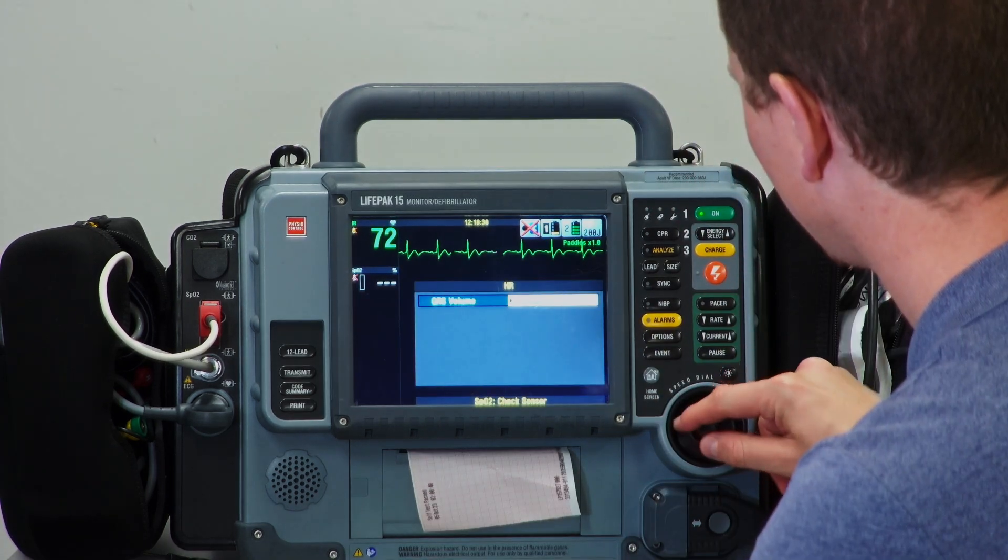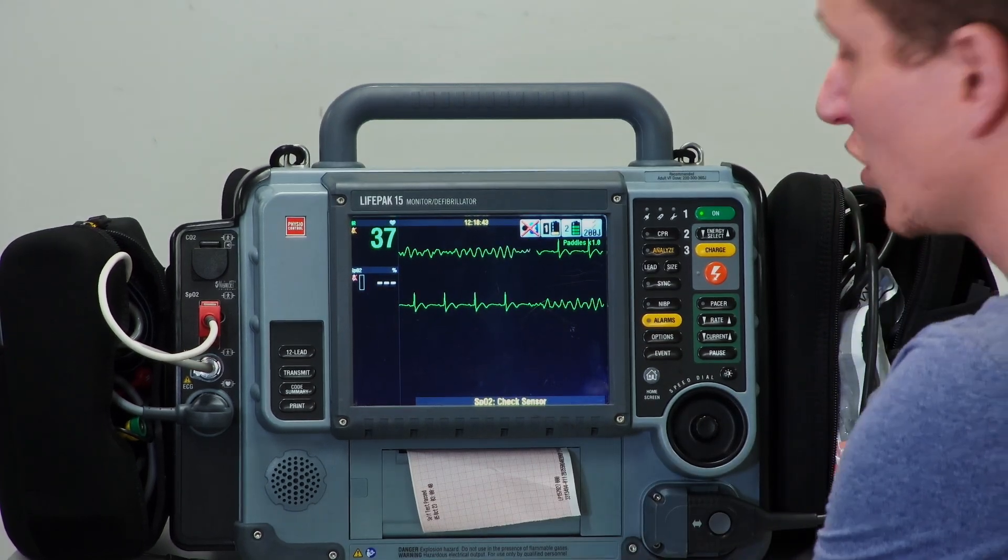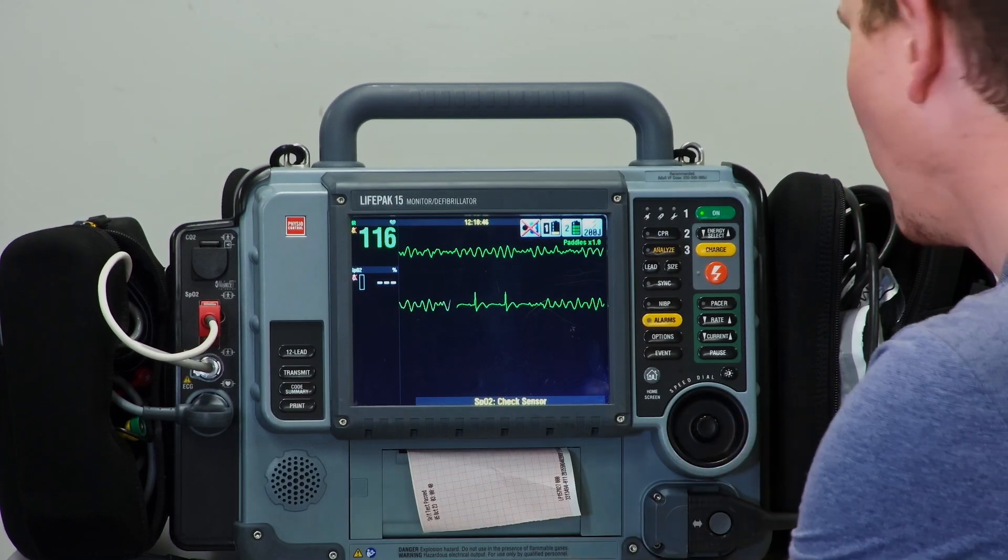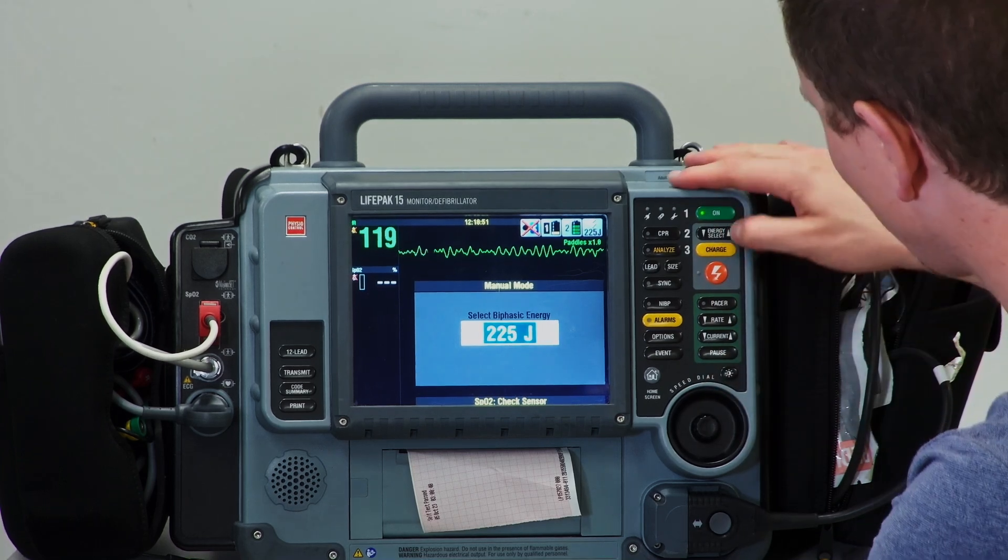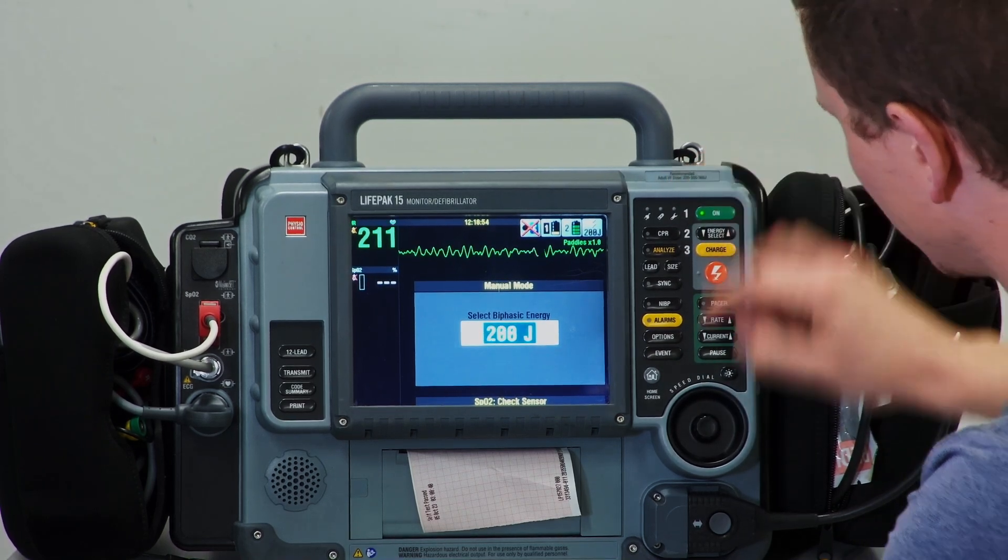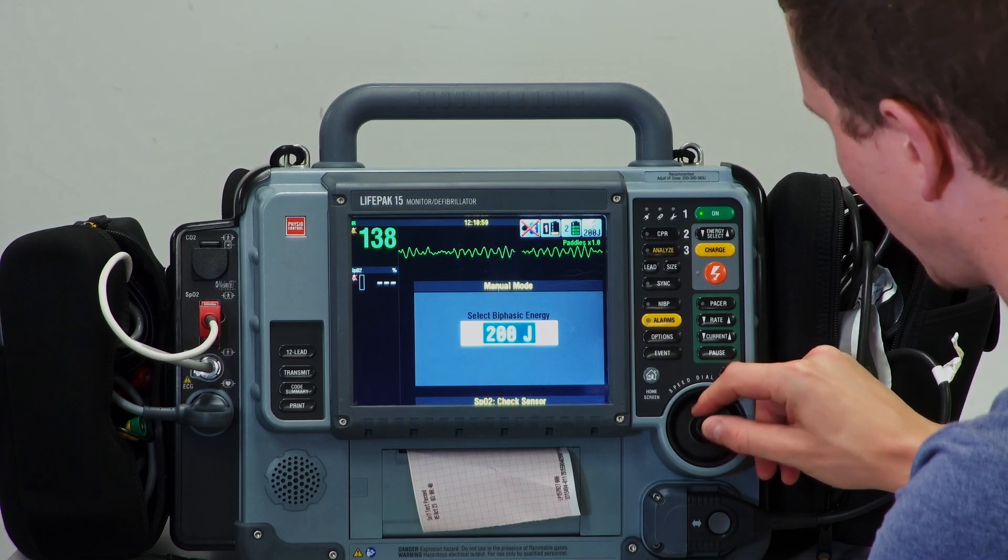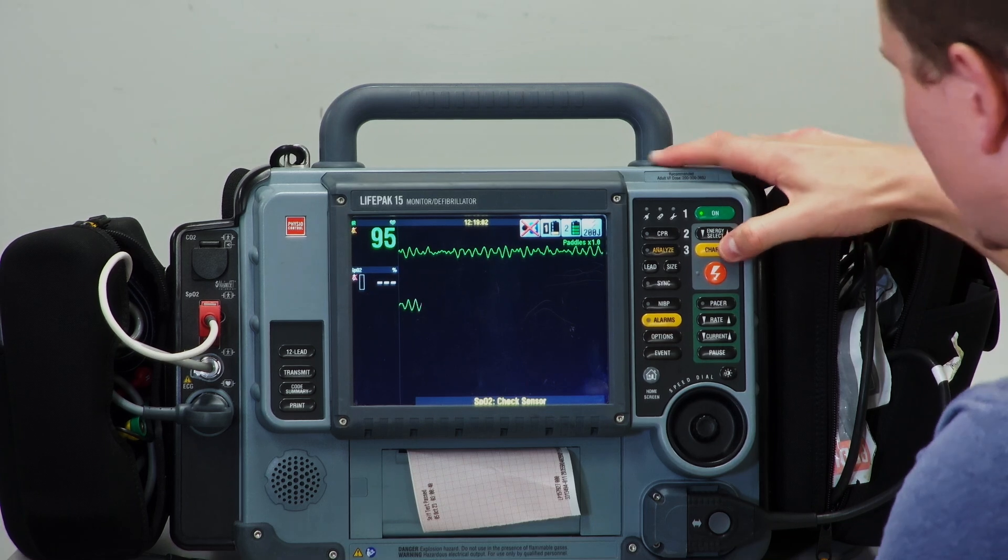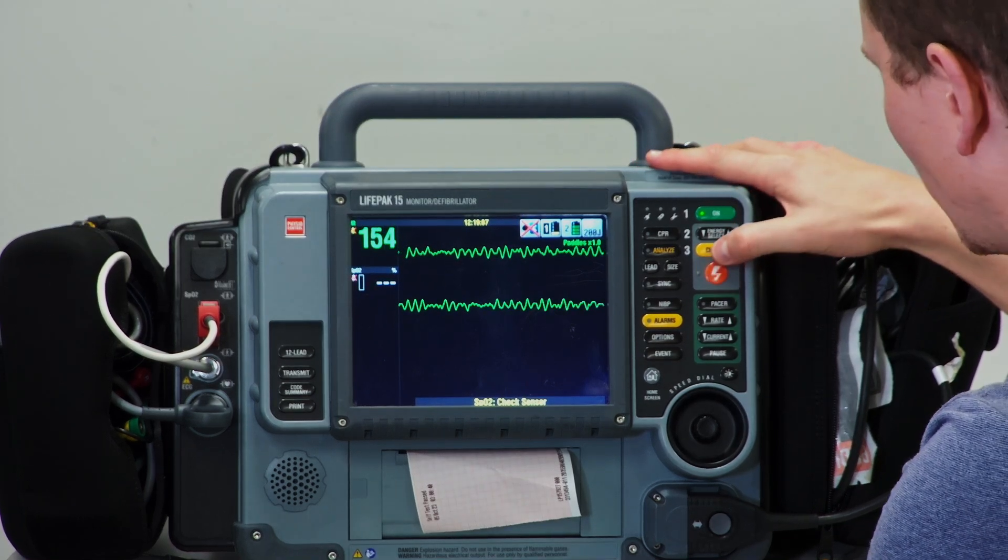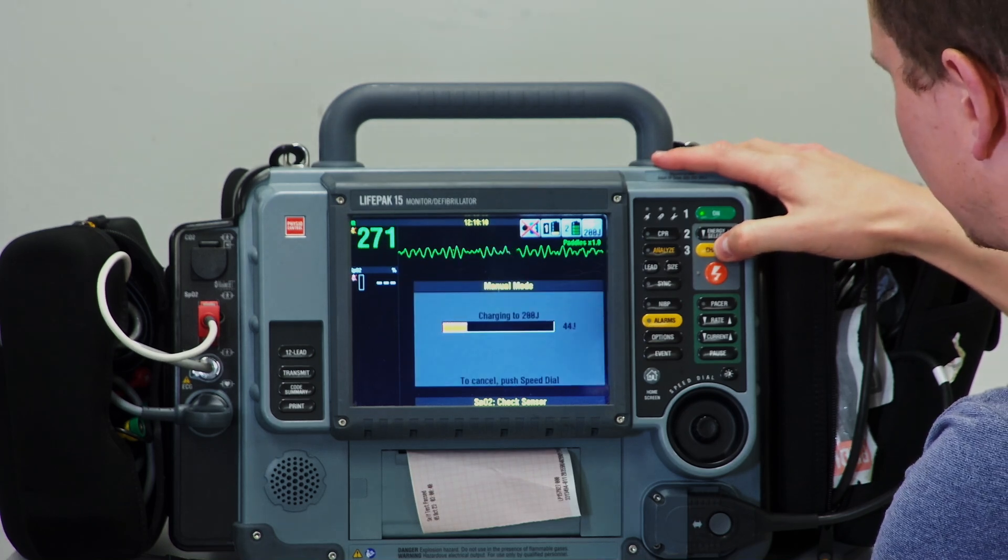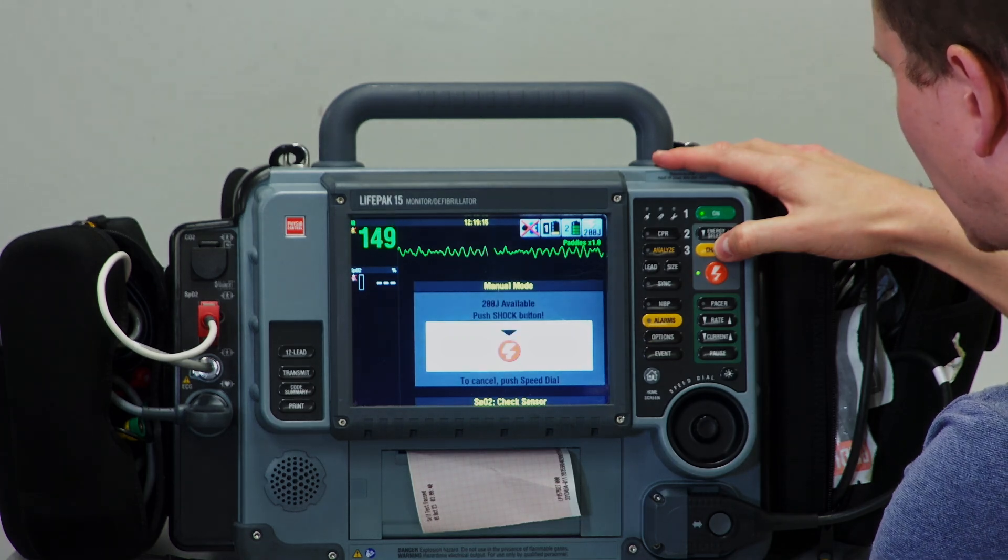Let's go through the defib or shocking. I've put it into a shockable rhythm—we are in ventricular fibrillation. If we want to charge, there's just a charge button. You can select the energy—if you select energy you can push up and down or rotate the dial and select whatever joules you want, then select in and it's done. To charge, you just hit the charge button, and once it's charged you can shock it.